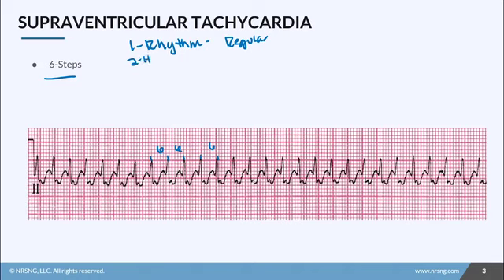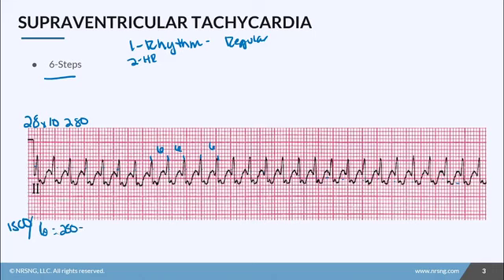Step number two, let's count the heart rate. Counting the QRS complexes across the six-second strip gives us 28 beats. So 28 times 10 equals 280. However, because it's abnormal, let's use the 1500 method because it's a lot more accurate. 1500 divided by six gives us 250 beats per minute. That is more accurate and very helpful with these kinds of rhythms, so our heart rate is 250 beats per minute.